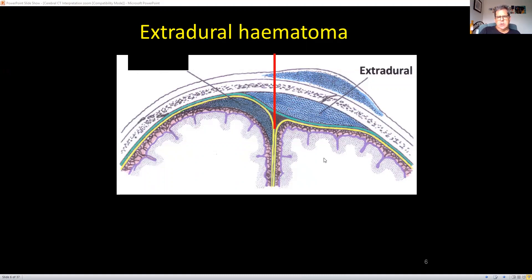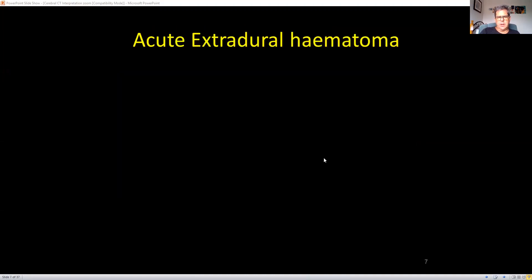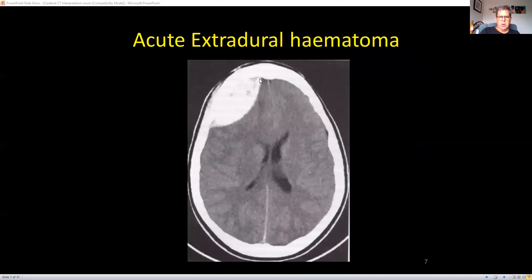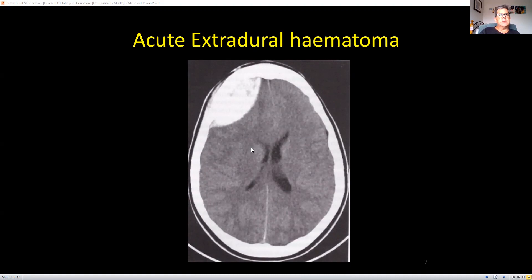Extradurals are relatively simple to see because they're usually overwhelmingly acute, so they look white on your CT scan. You can see that convex shape pushing into the underlying cerebral tissue. There will be a fracture on the bony window. You can see the arterial bleed pushing in here and causing displacement of the lateral ventricle — the lateral ventricle gets effaced. There's also a midline shift; you can see about a centimetre of midline shift at the top.